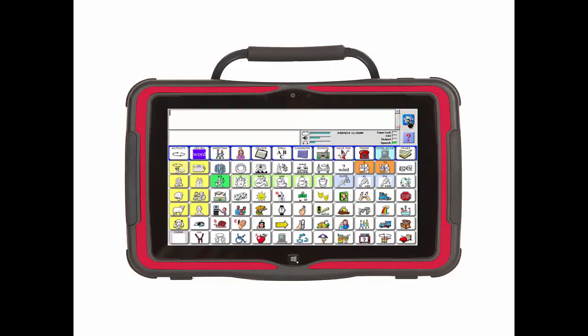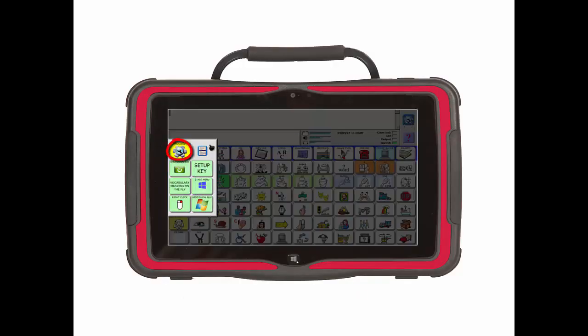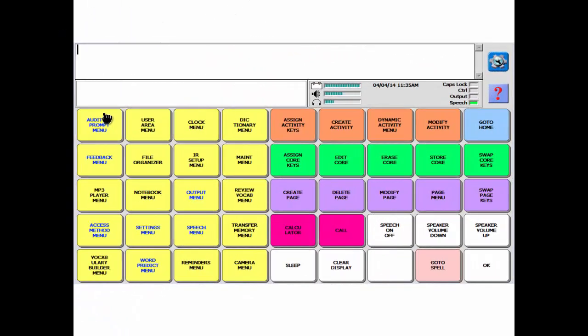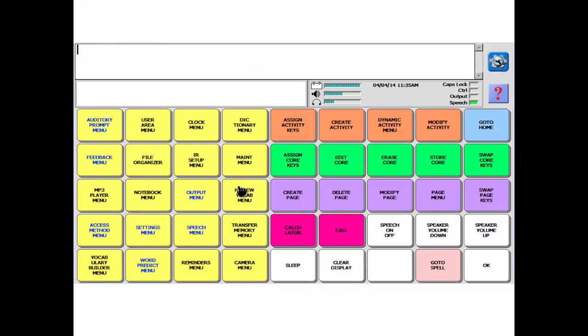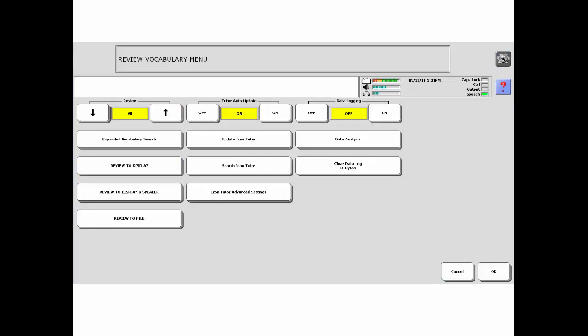To turn data logging on, enter the toolbox. Then select Review Vocab Menu. It is a yellow key in the third row. Look to the right to find data logging.